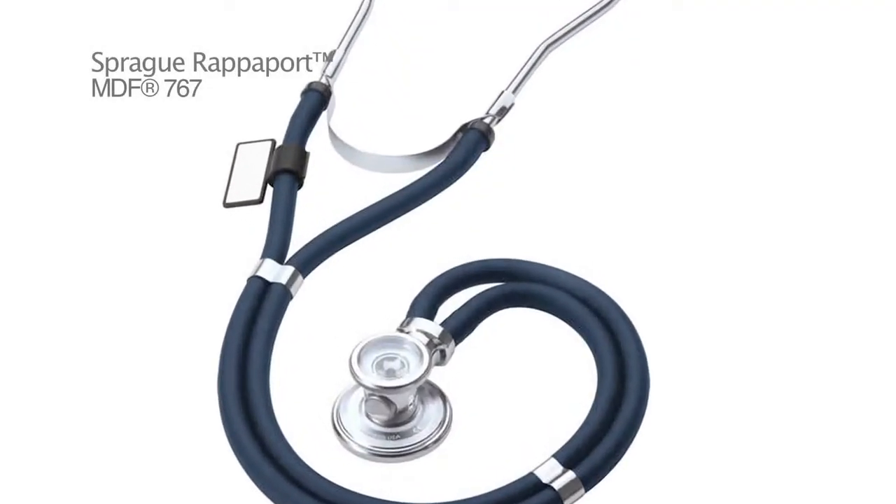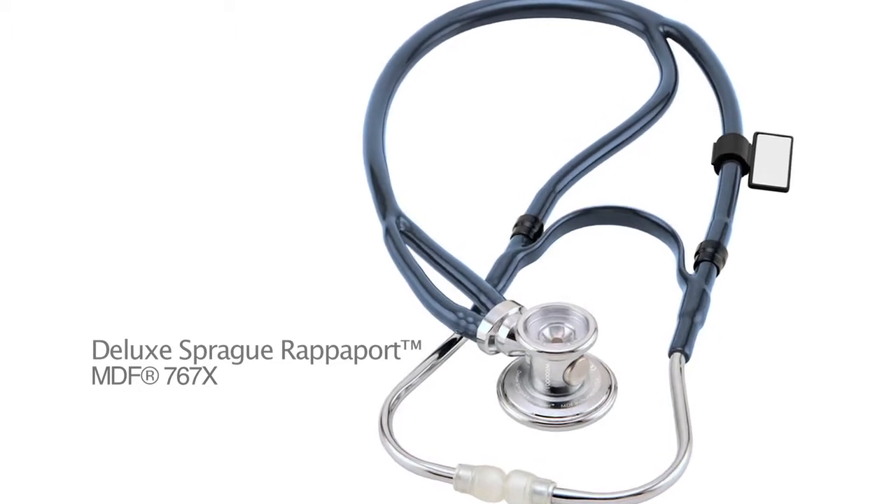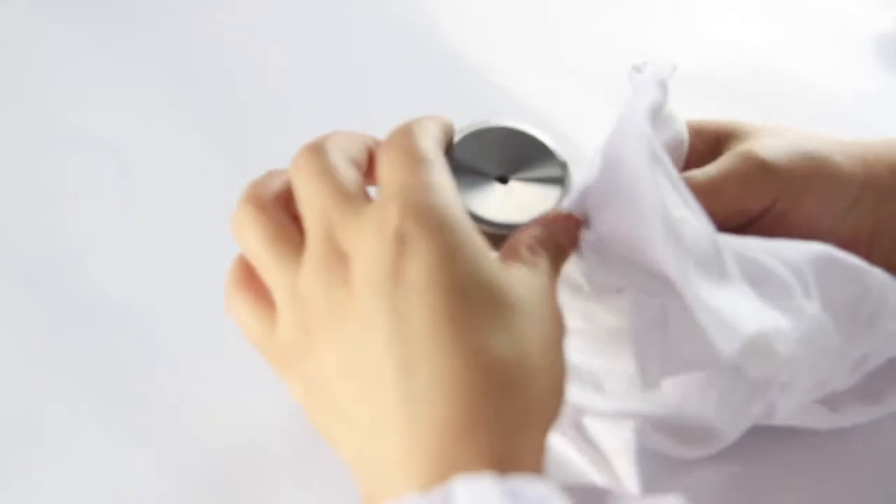About 50 years ago, two doctors, Dr. Sprague and Dr. Rapoport, came together to design a new stethoscope, which became known as the Sprague-Rapoport stethoscope. It's been through a lot of changes over the years. It's still very easily identifiable by its dual tubing output and its convertible chest piece. This makes it really popular with doctors, nurses, and veterinarians, as well as educational institutions for their students, primarily because of its flexibility and its ability to act as five stethoscopes in a single instrument.